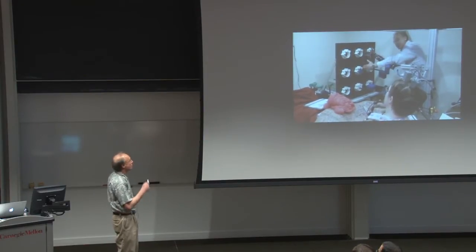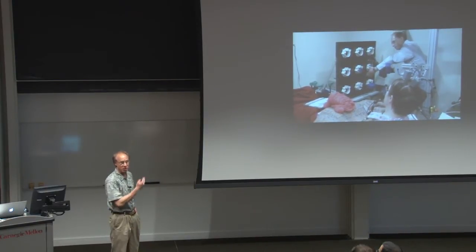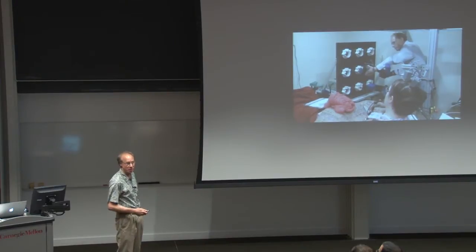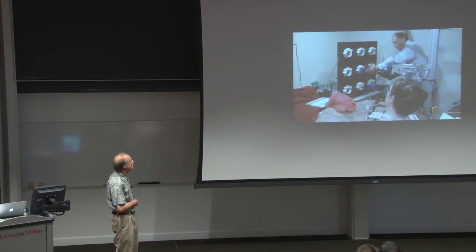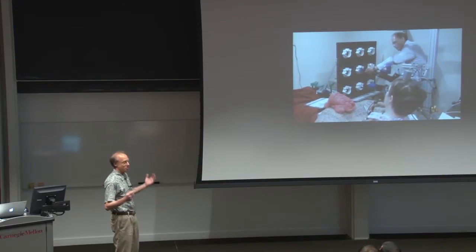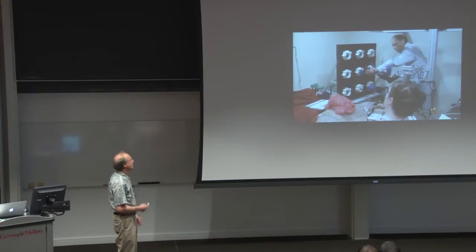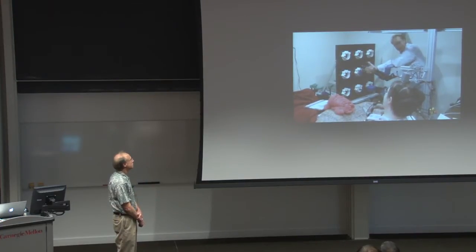Awesome. All right. What we did is we had her observe movement in different directions, and we built our tuning functions based on observed movement. And then we just had her use this. So again, this was 3D movement almost right away. There you go, you got it.